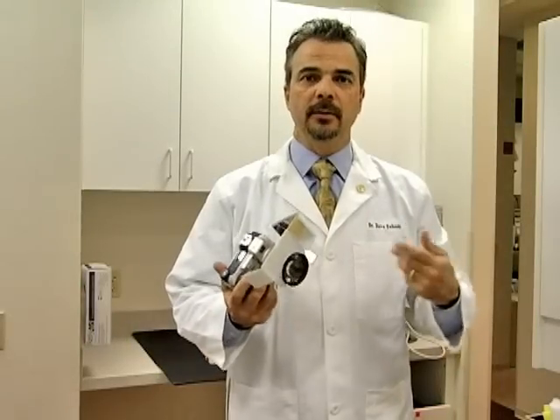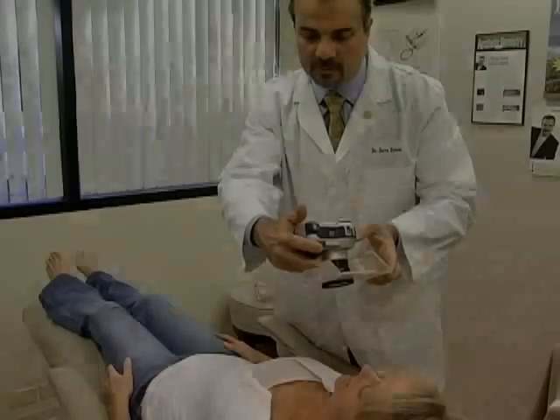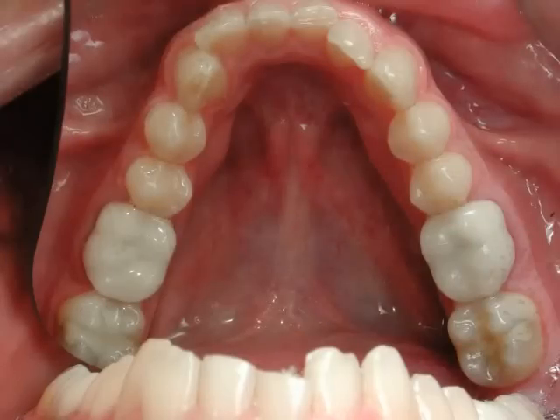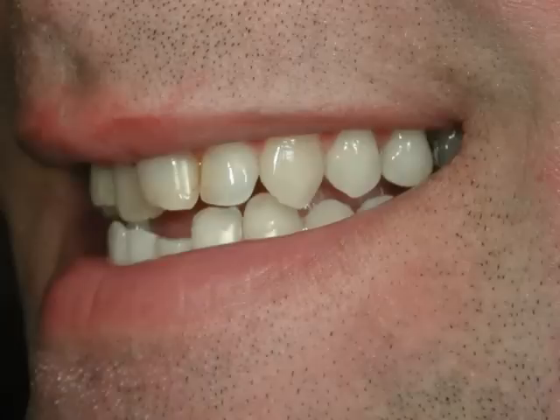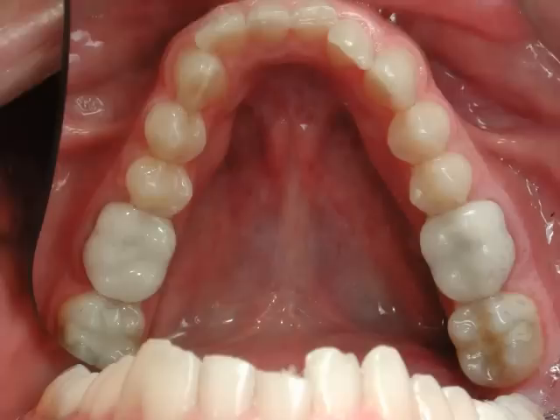Part of being thorough and doing a great exam for patients is using an external camera. We use this camera to take pictures of patients' smiles and their teeth, and then I actually give the patient a tour of their mouth with these pictures. I find that that helps patients understand their mouth better, and if they understand their mouth better, they can keep it healthier.